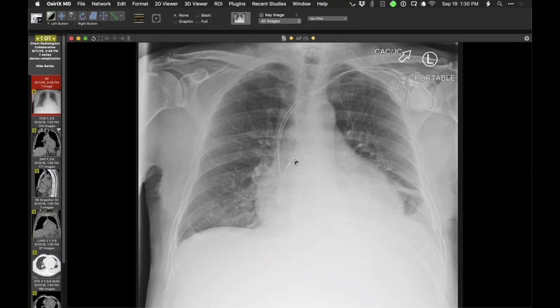Don't you think this one is a little bit unusually high, the tip of it? It usually goes to the atrial appendage and sweeps and makes the curve where the tip projects about. I've never really thought about the height of it, if they have atrial fibrillation and a big appendage. Yeah, could be. But in my experience, they typically don't project that high, the tip that is, because the curve is anterior, then it attaches to the anterior atrial appendage. And the tip, I think that's a bit high.